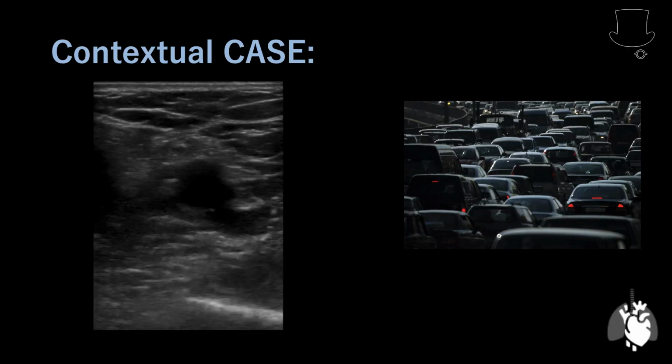Finally, be humble and avoid ghost scanning. Good practice is to archive your images and have a system of quality assurance, especially when you're making diagnoses with major implications for your patients.